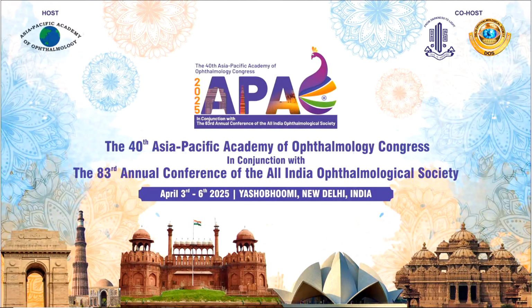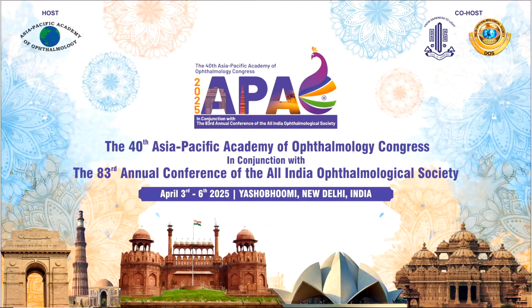Dr. Anagha, one question. You said neuroadaptation. So what is the time period that you tell your patient for neuroadaptation? So it depends on their age. For any trifocal also that holds true. If it's a young patient who is motivated, he will take a lesser time to neuroadapt, and if you are also doing the other eye immediately.